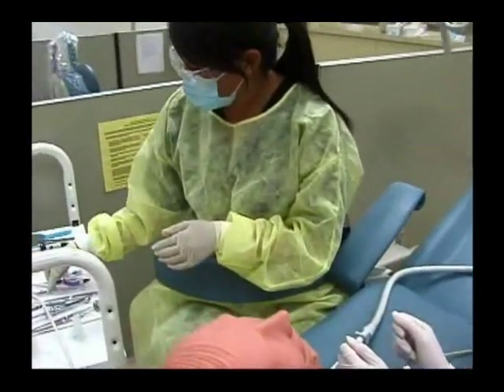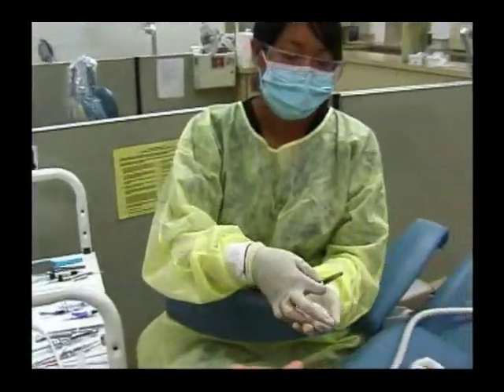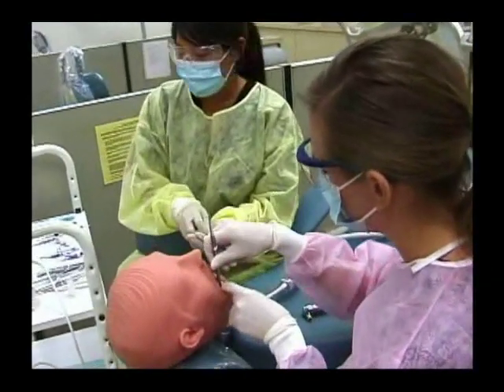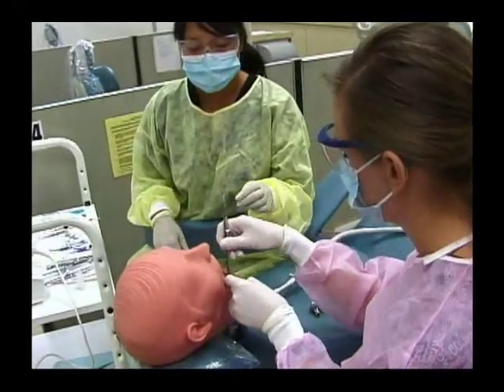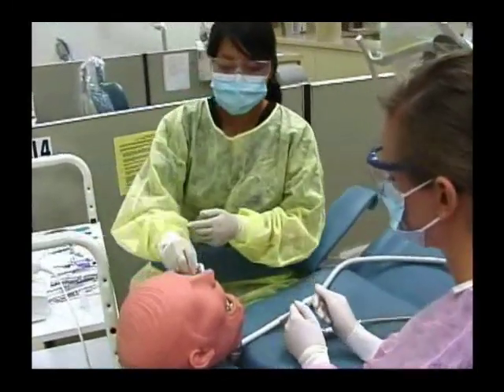Once the tooth is prepared, she would isolate the tooth. We'd place a saliva ejector in the mouth.